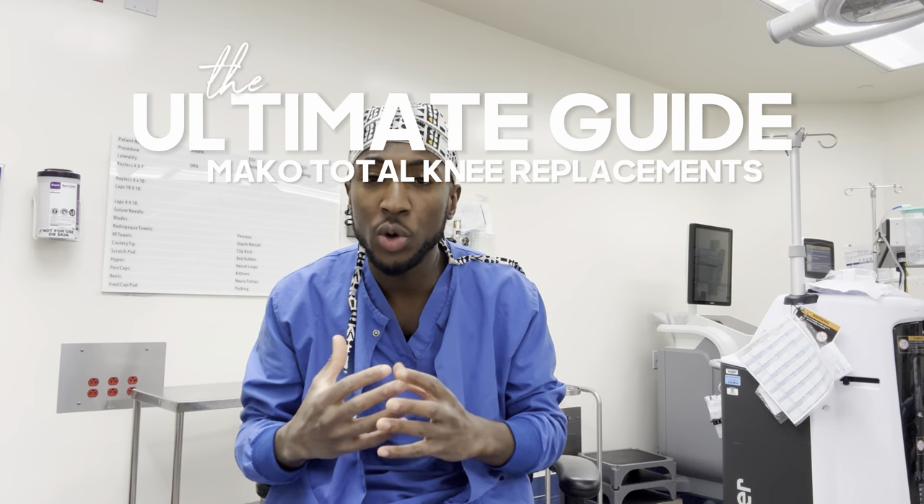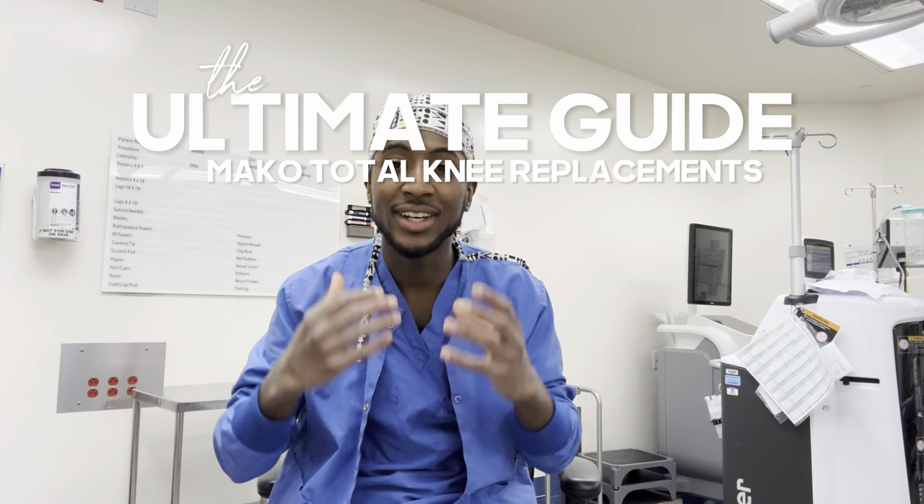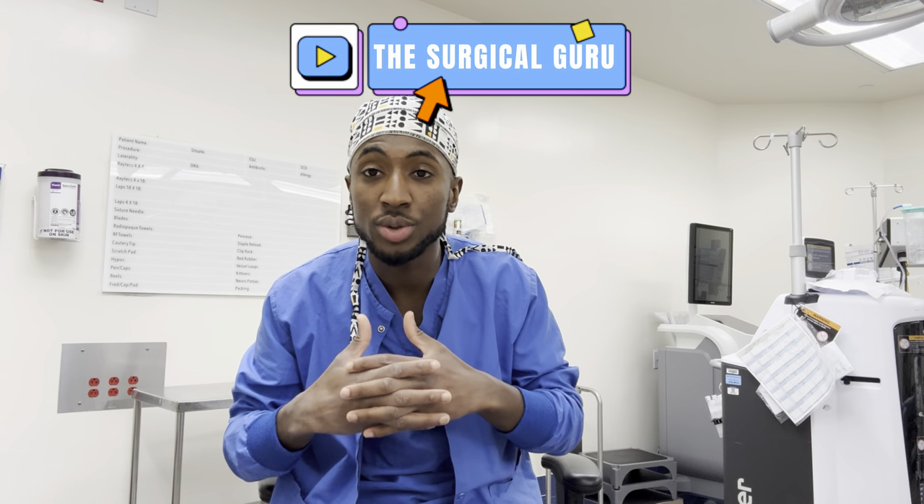An ultimate Mako Total Knee Replacement Guide — for beginners, for people who are more experienced in surgical technology who want to learn how to scrub orthopedics. This is where the future is headed: Mako Robot Total Knees. This guide will take you from beginning to end so you'll understand how to scrub Total Knees and confidently help your surgeons do Total Knee procedures assisted by the Mako Robot.